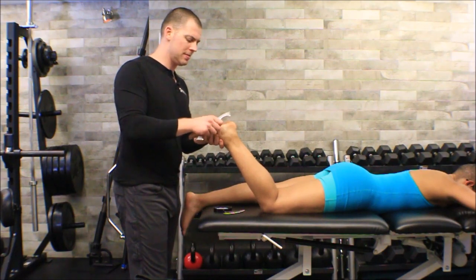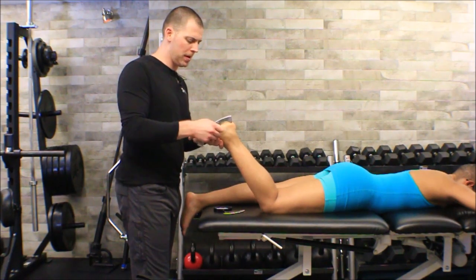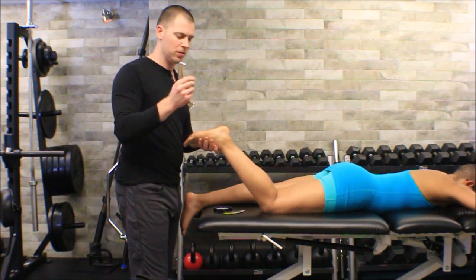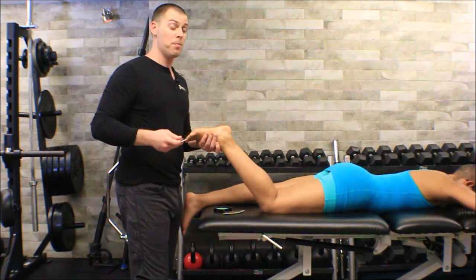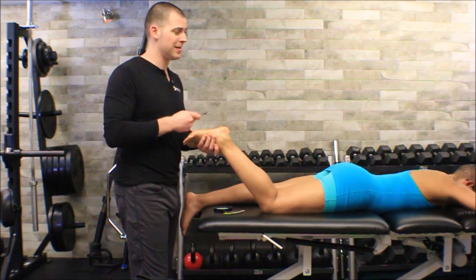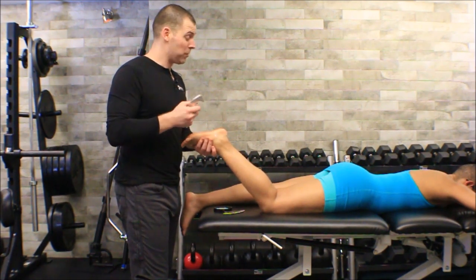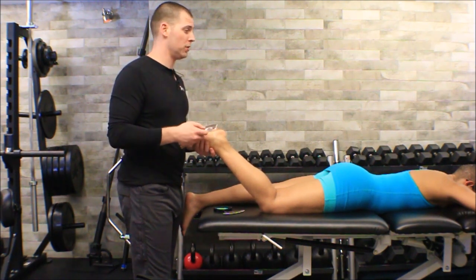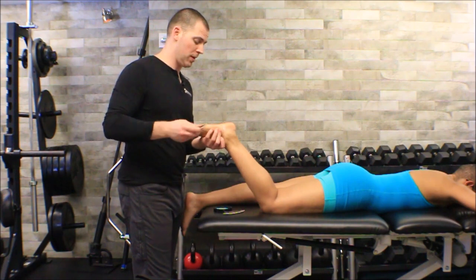Usually you get a bumpiness in areas where we think there might be some dysfunction. And right in the medial longitudinal arch, he does have a little bit of that bumpiness. Now, with that being said, I now want to go through in different directions, but because it's her foot, I want to be intentional and quick. If you keep at the plantar fascia, you're going to drive your client or patient right off the table.